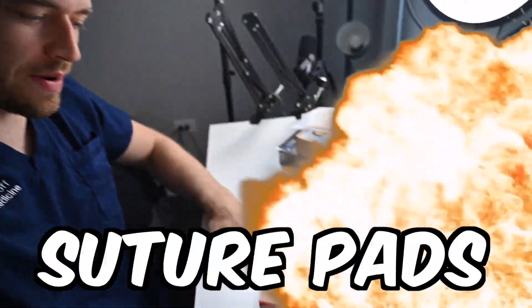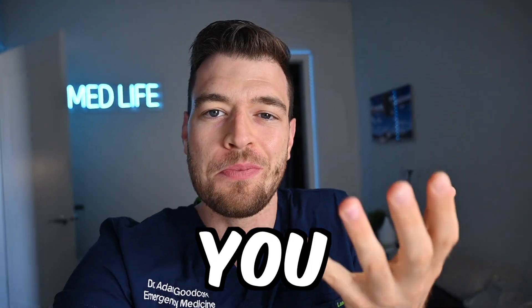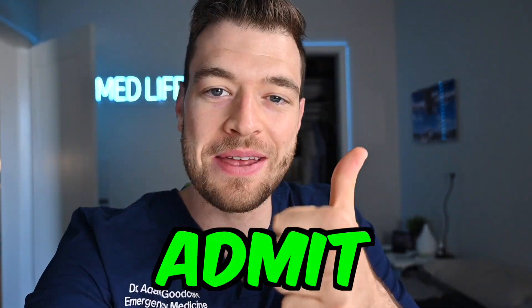It's time to review some suture pads. What do they come with? How do they perform? What's my opinion? And should you buy it? We're going to use my rating system: admit, observation, or discharge. Let's get right into it.